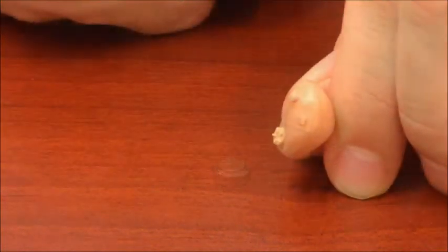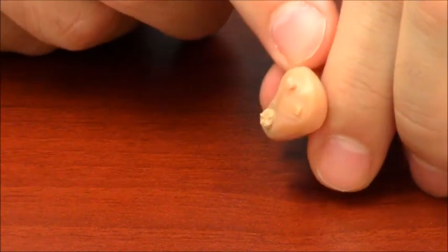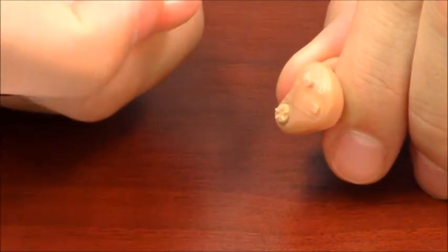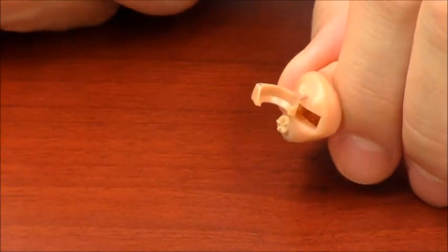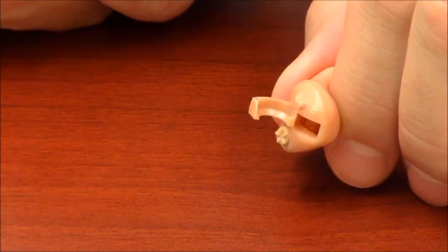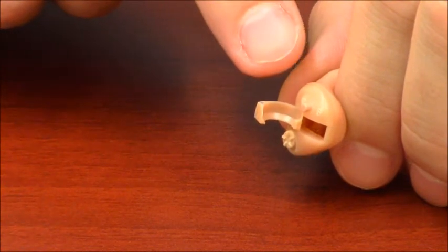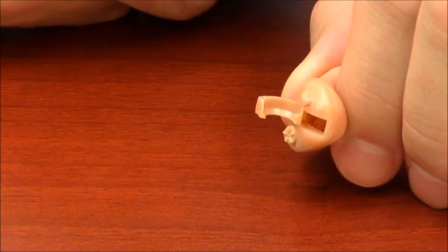So for our first type of hearing aid battery door, which is a pull-out tray model, to open it, there'll be a ridge on the faceplate. And basically you want to take your finger or your nail and just pull out from that ridge and open the tray up all the way. If you're looking at the tray, you can see that there's two different openings. So on the top, it's a much larger opening than the bottom, which is a smaller opening.